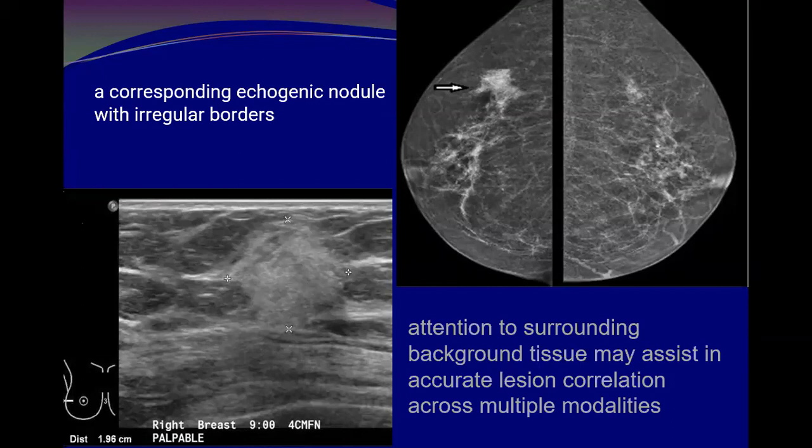In this case, sometimes they might do a 90-degree lateral view looking for the lesion, and sometimes just do ultrasound and expect the lesion to move in the same manner as on the 90 degree. If a lesion is lateral, what do we expect to move?